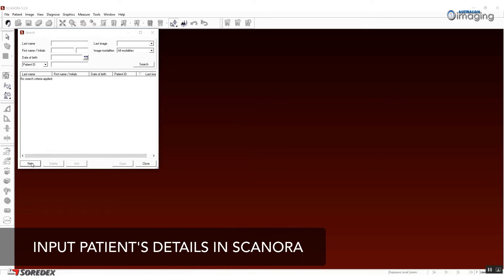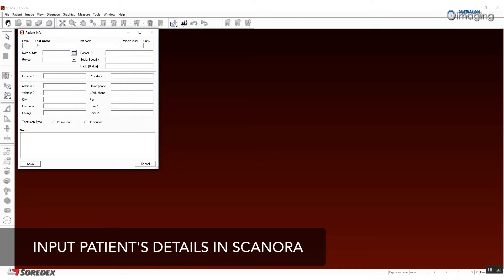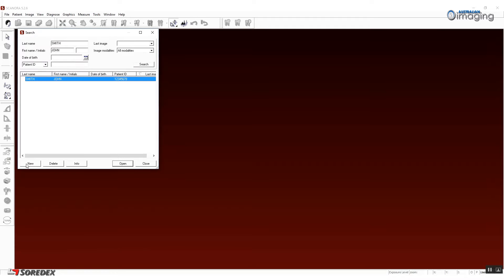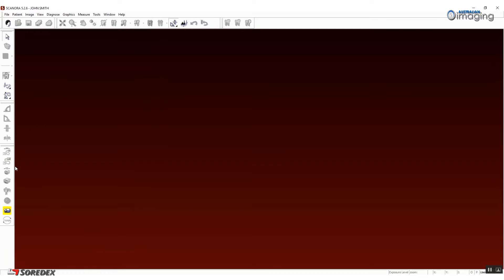The first step is to prepare the patient in Scenora. Open your Scenora software and input your patient's details, then select the patient from the work list and click CB3D capture.